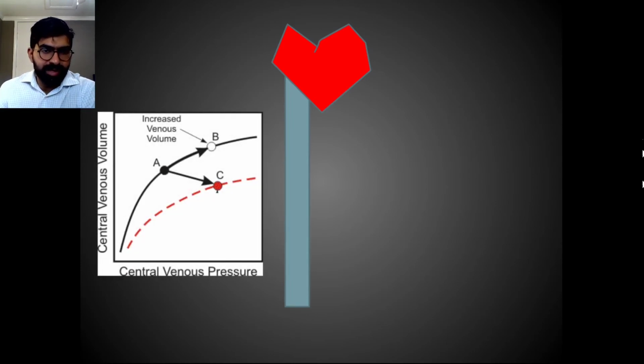As you guys remember some of these curves, the venous volume is also up, and so is the pressure, okay? And it's with this increase in volume and pressure that when you don't really have room for the vein to expand anymore, every heartbeat is actually transmitted back down as a waveform into the legs.